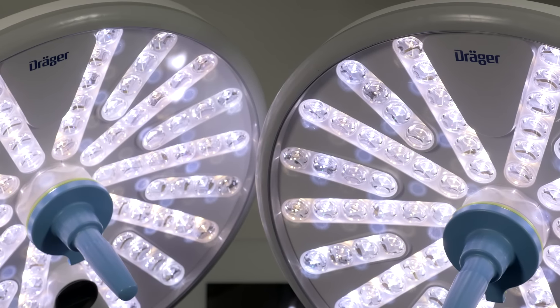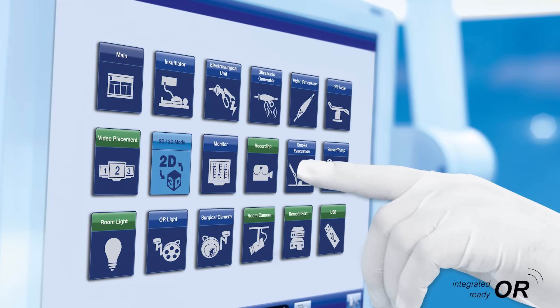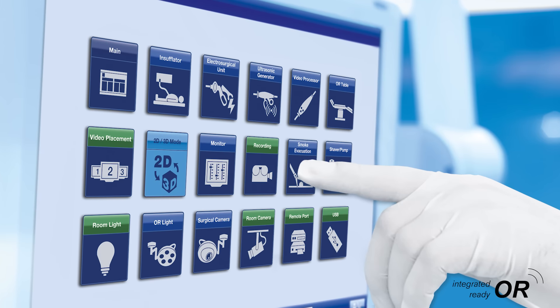The Polaris 600 also has an integrated surgical interface. This enables you to use a touch screen to control different devices such as light and video systems through an integrated system with our worldwide partners.